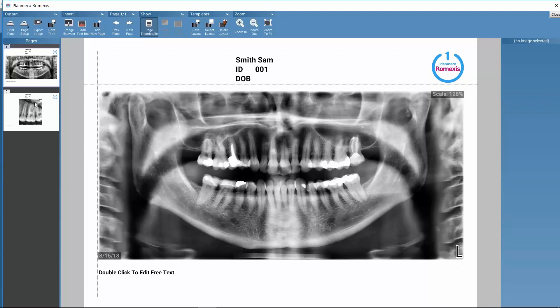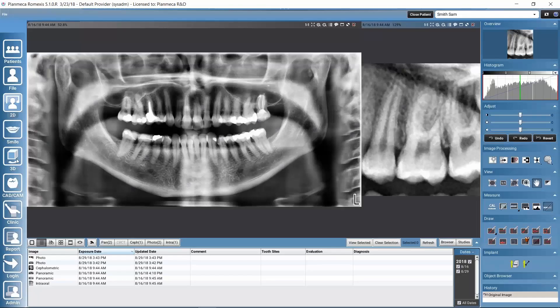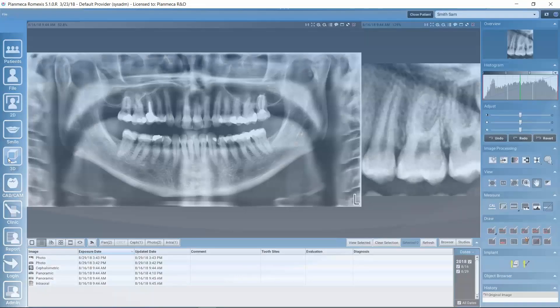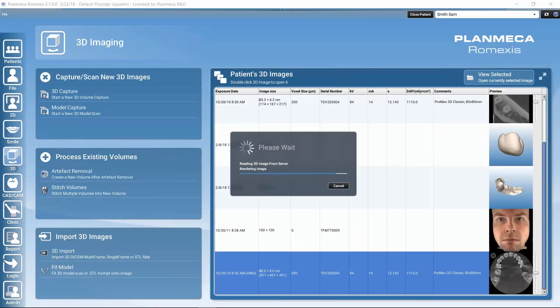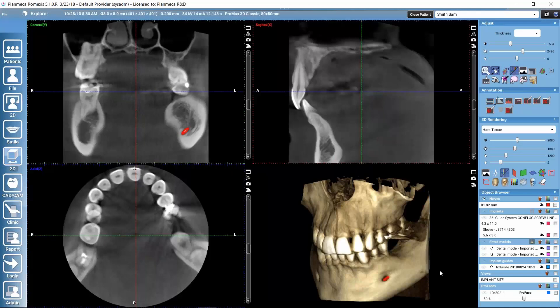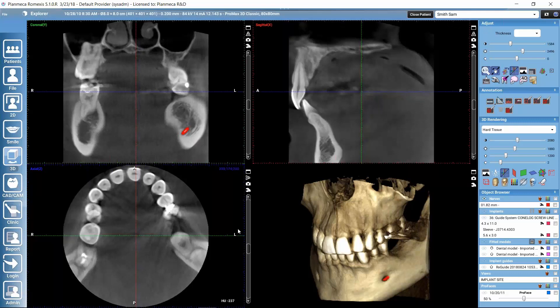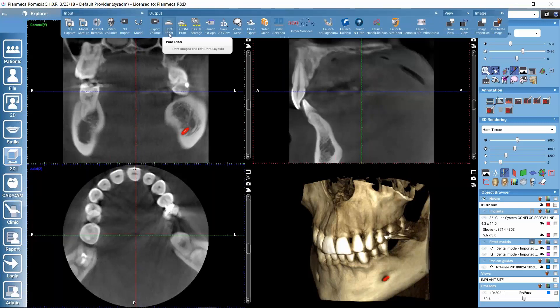They got placed to their respective image slots. Let's close Print Editor and this time go to Print Editor through the 3D imaging module. Let's open a CBCT volume. Naturally we could take 2D snapshots here in the 3D imaging module and they would be saved in the 2D module, but we can also directly access Print Editor from the 3D imaging module. We could adjust the view, adjust the image, add annotations, change the orientation, and so on until we have the kind of view that we want to print out. Then we go to the upper toolbar and select Print Editor.